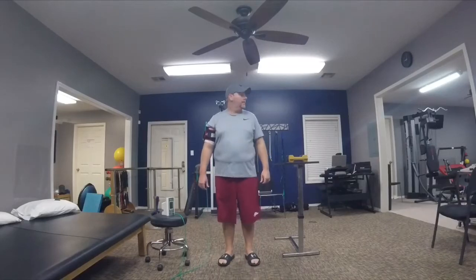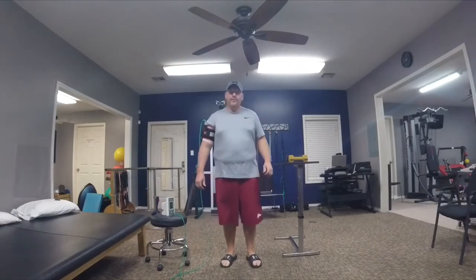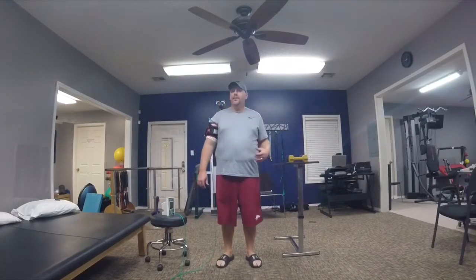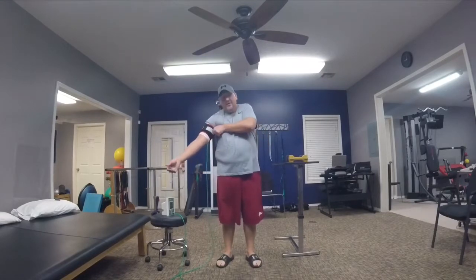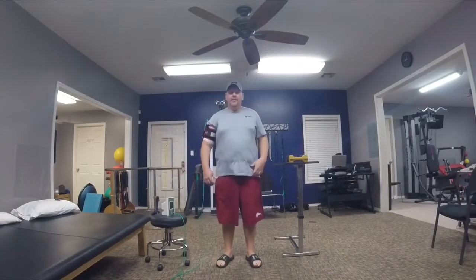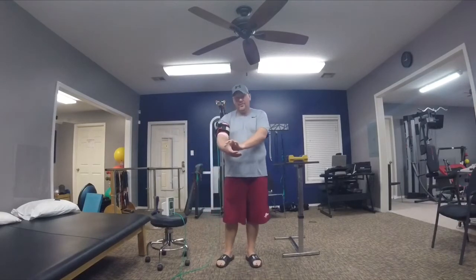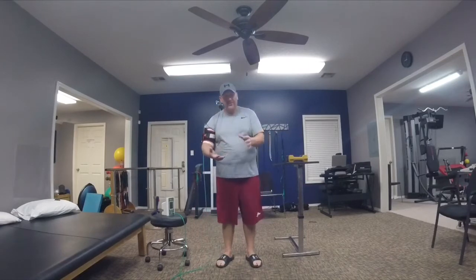Hey everyone, so today I'm going to demonstrate a rehab technique that we use here at Green Physical Therapy and at our other clinic, Big Physical Therapy, called blood flow restriction. The technology behind blood flow restriction is such that you basically restrict blood flow to the distal extremity, whether that be an arm or a leg, and with that you get a hypoxic state in that extremity.